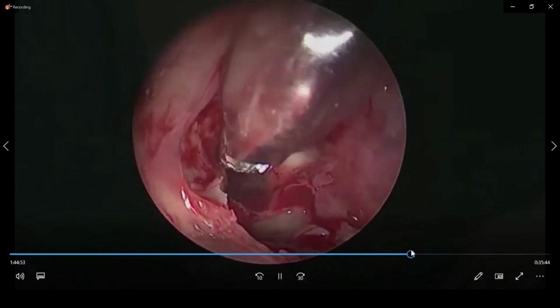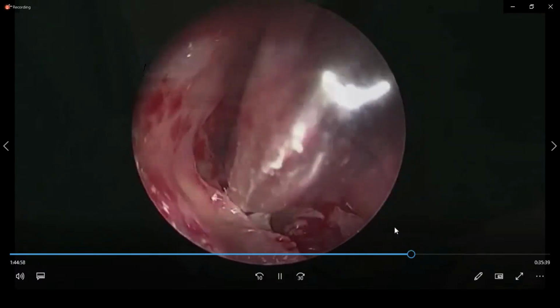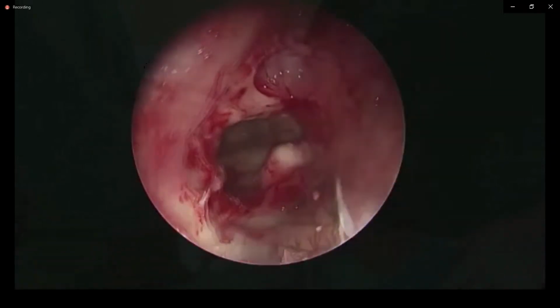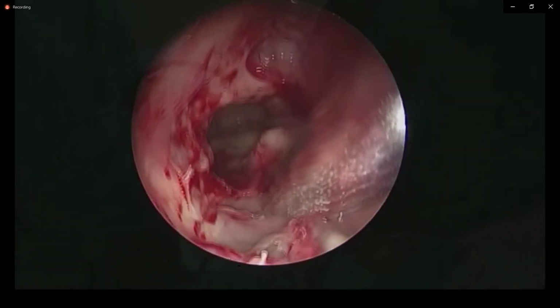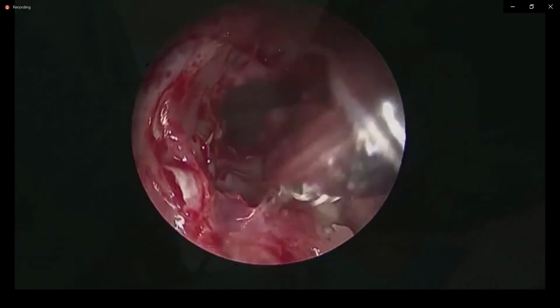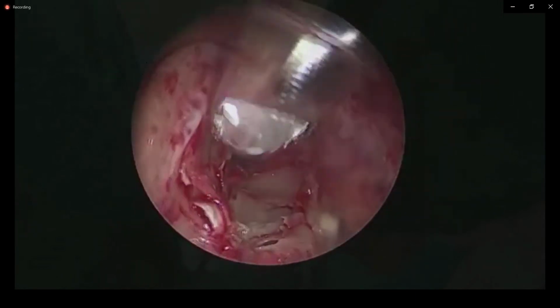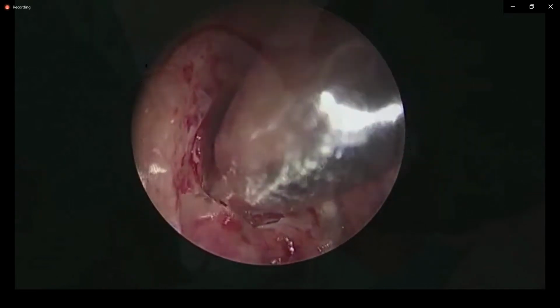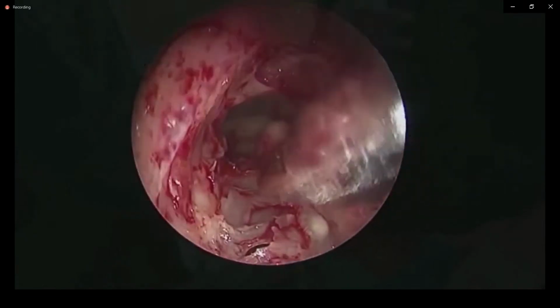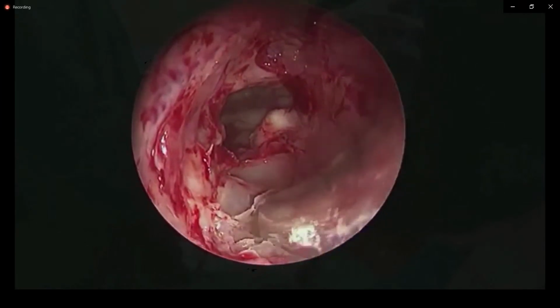See now the reverse blade. Reverse blade will ensure, see this is, we call it a skull base blade. As with 70 degree, it becomes a front facing blade. See this, you can clear your skull base. Flush your skull base with the reverse blade. And once you use reverse with 70 degree, the cutting edges come into your view. See the cutting edges. The important principle of micro debrider is to keep the cutting edges under vision. With this 70 degree, you can keep your cutting edges under vision.